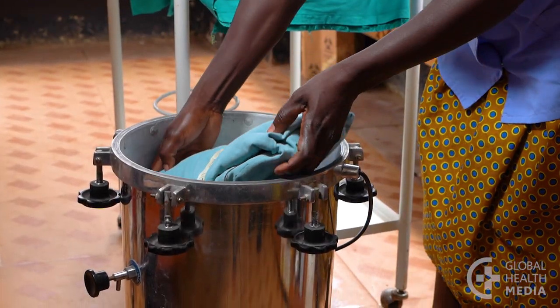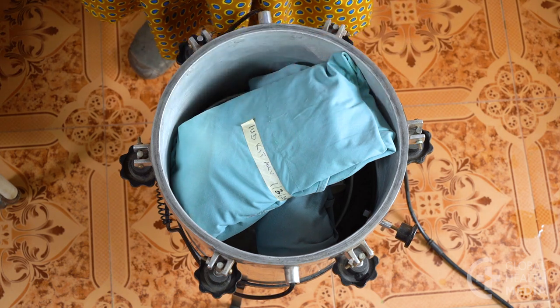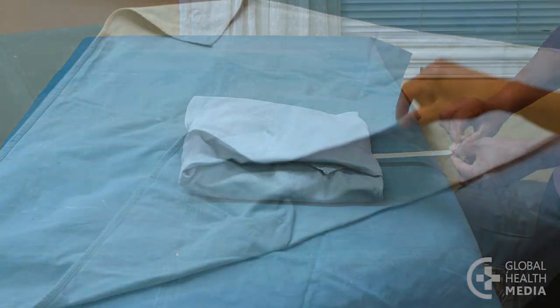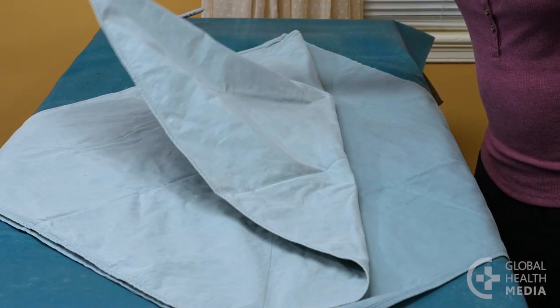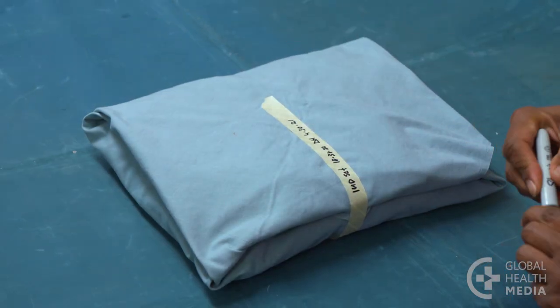It is important to wrap surgical instruments correctly so the steam autoclave can sterilize them completely and the package can be opened later in a way that keeps all the instruments sterile. This video shows one way to wrap surgical instruments for an IUD set.